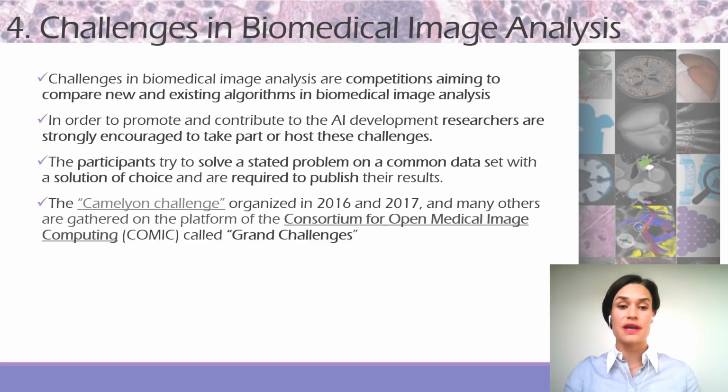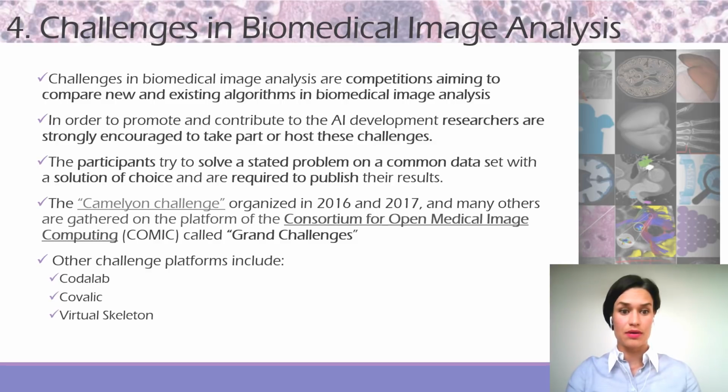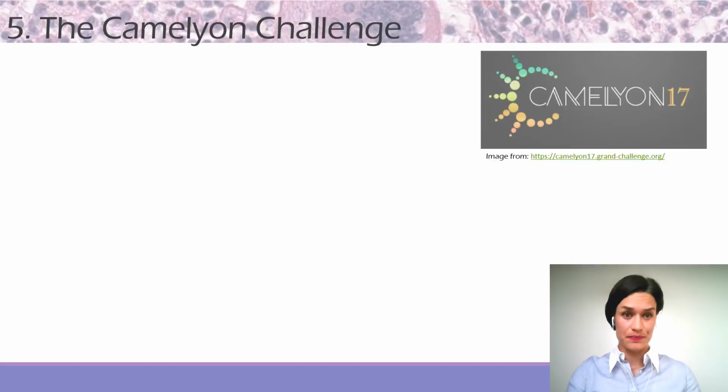The most famous challenge in pathology was the Camelyon challenge, organized in 2016 and 2017. This and other challenges are gathered on the COMIC platform, COMIC standing for Consortium of Open Medical Image Computing, and they are called Grand Challenges. They are the most famous in biomedical image analysis, but there are also other platforms hosting them, and these include CodaLab, Covalic, or Virtual Skeleton.